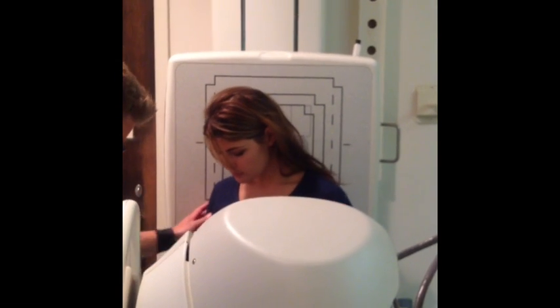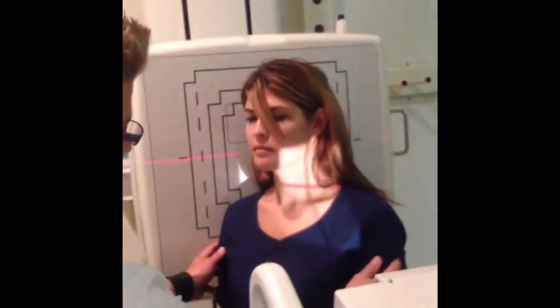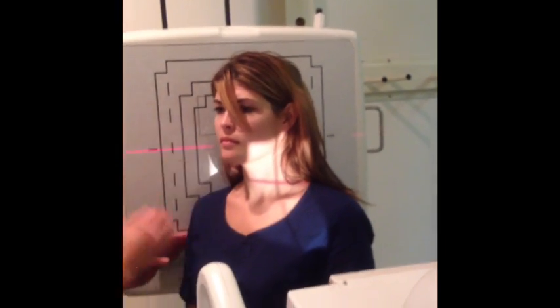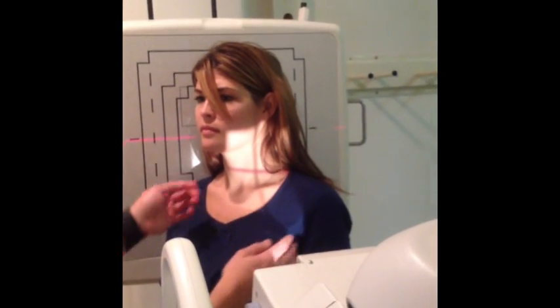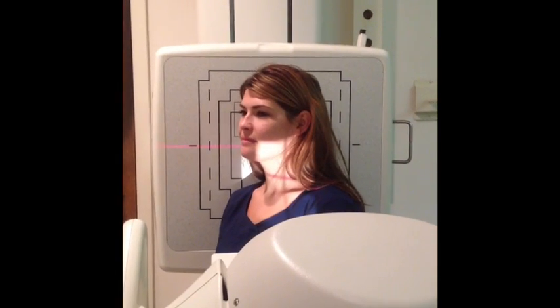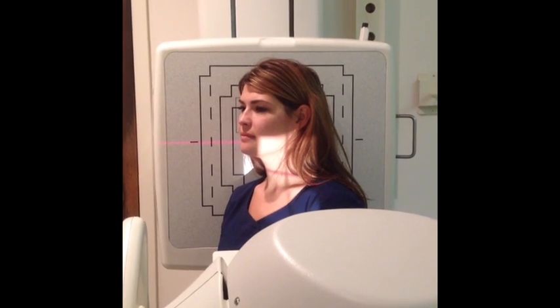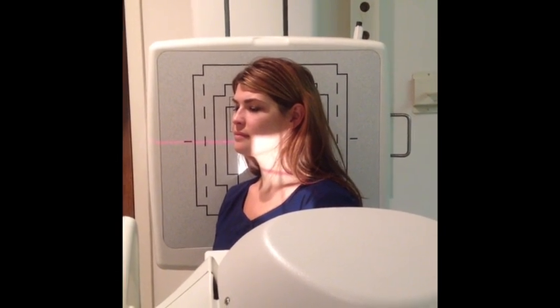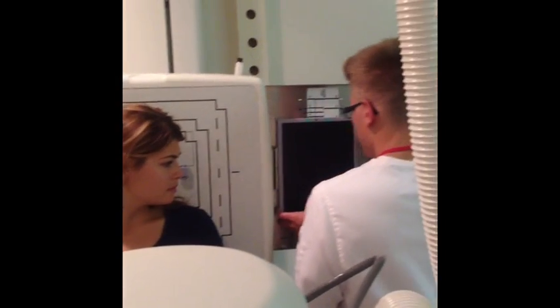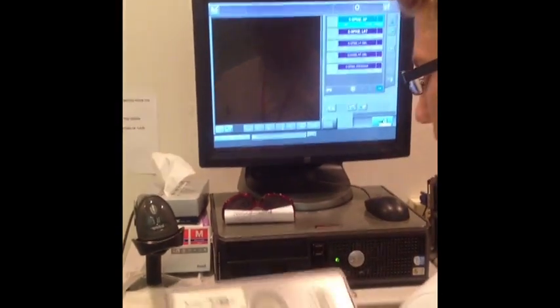I'm going to have you turn this way — just put your feet facing me. Once again, I'm centering at C4. Chin up. Set my technique to an oblique C-spine, which is 75-25. And x-ray. That was the right oblique — I'm going to run it as a right oblique.